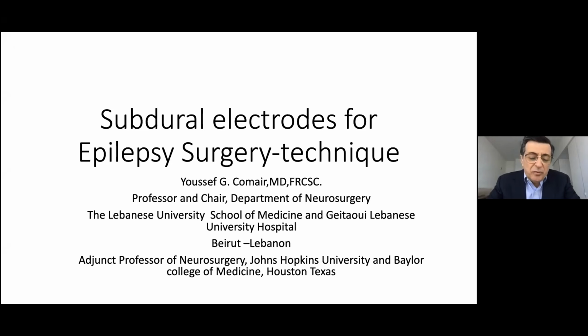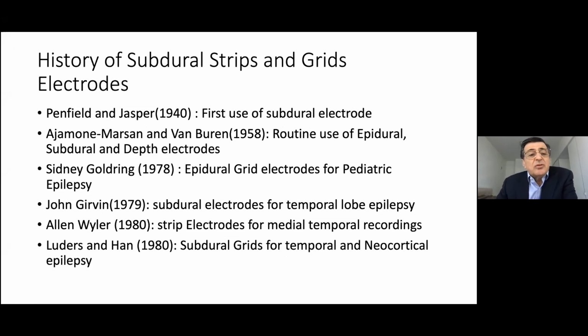Thank you. First, thank you very much for asking me to join you and discuss subdural electrodes. It is a pleasure to be with this group. I will start by talking about the history of subdural strips and grids. Perhaps it offers a perspective on the current usage of strips and grids and the continuous controversy between SEEG and subdural.